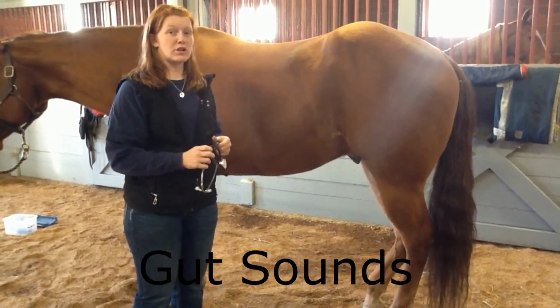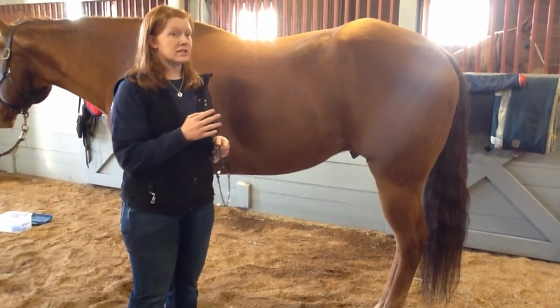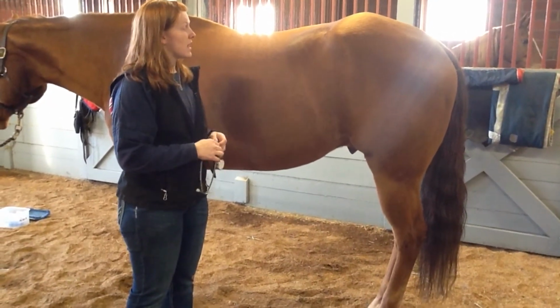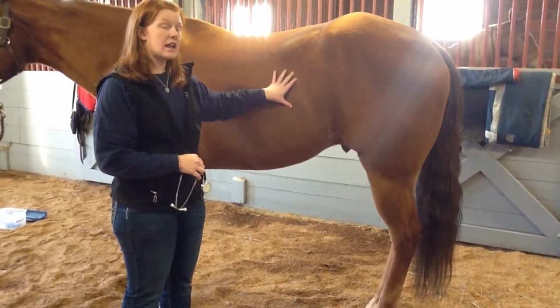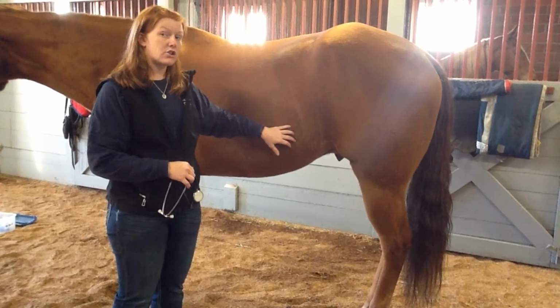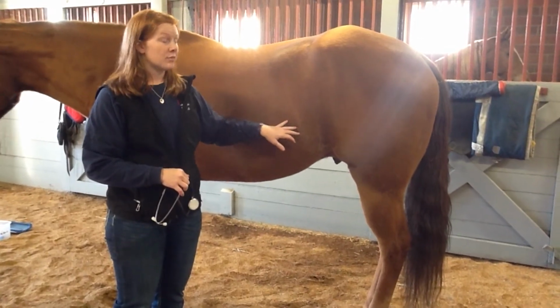The next vital sign I'm going to demonstrate is gut sounds. Gut sounds can be very important to a horse's overall health, as when listening to gut sounds, you're listening to the movement of food moving through their digestive system. You're going to listen in the upper and lower quadrants on both the left and the right side, as there is a chance that something could be wrong in one of the quadrants, and if you don't check all 4 quadrants, the one that you don't check could be the one having problems.